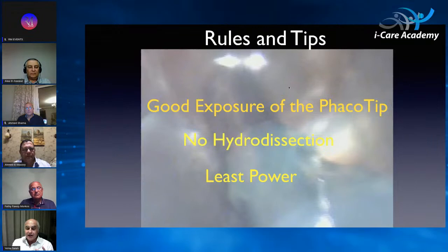Third, you have a higher risk of capsule rupture or capsular block syndrome if you don't see the wave with the hard nucleus and the fluid collects behind the nucleus in front of the posterior capsule and it can rupture. And as a general rule, if you have a hard nucleus, you don't have to use too much power. Use the power needed to do the job, as we are going to see.